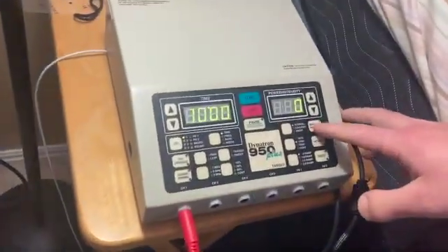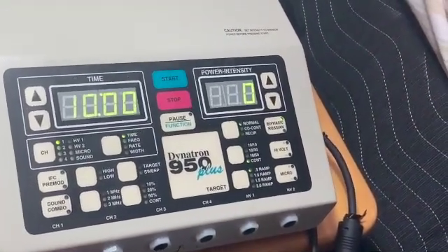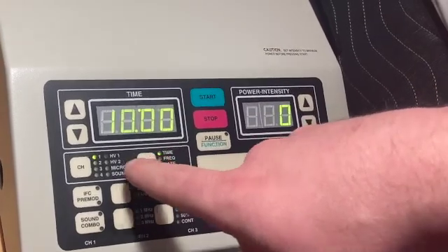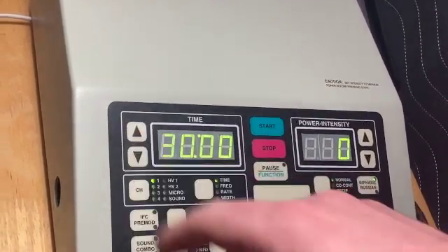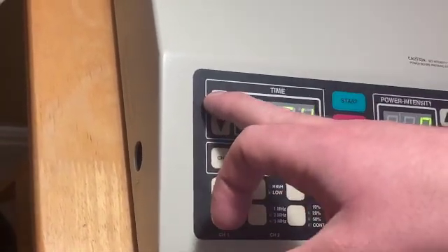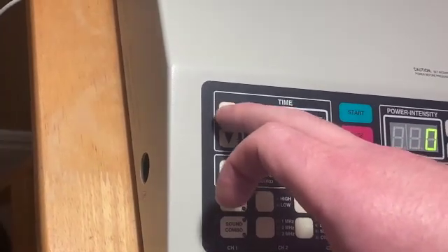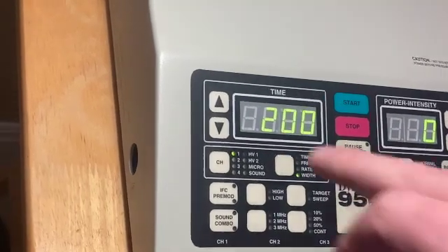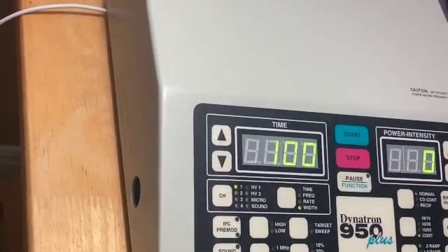So we're going to put it biphasic. We're going to put our duty cycle to continuous because we want that continuous paresthesia, that tingling, that stimulation of the beta fibers to utilize this gate theory. Time, we're going to put this up to around 30 minutes for this treatment. Our rate can be anywhere between 80 and 110, so I'm going to use 100 for this treatment. All right, and then our pulse width, we want that to be below 200, so I'm going to go to the 100 range to get that paresthesia, that A beta stimulation.